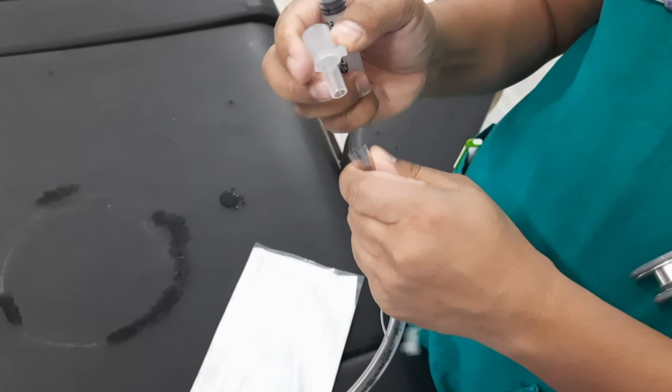Endotracheal tube connectors connect the endotracheal tube to the breathing system. One end of the connector connects to the endotracheal tube, and this end has a diameter that depends on the endotracheal tube size. The other end connects to the breathing system and has a 15 mm outer diameter. Endotracheal tubes are often not directly connected to breathing systems; instead, to provide a more flexible connection, they are often connected to a flexible catheter mount, which is then connected to the breathing system.